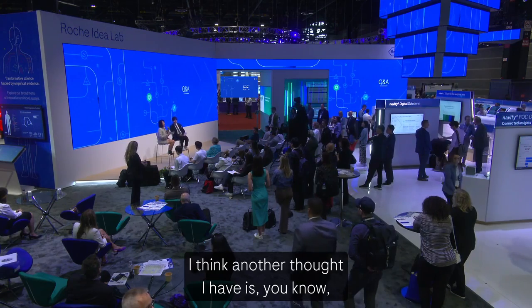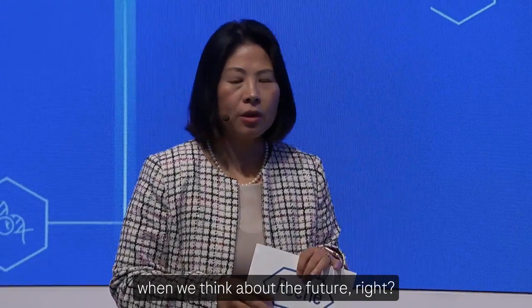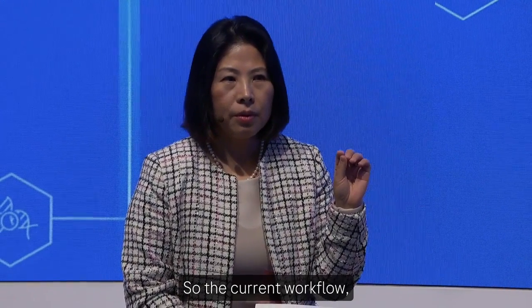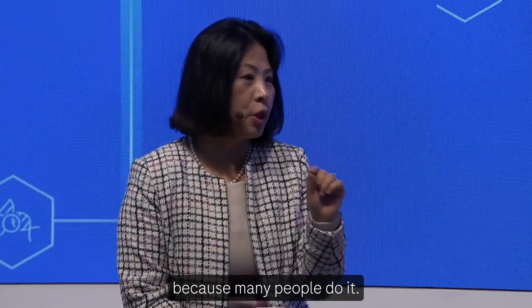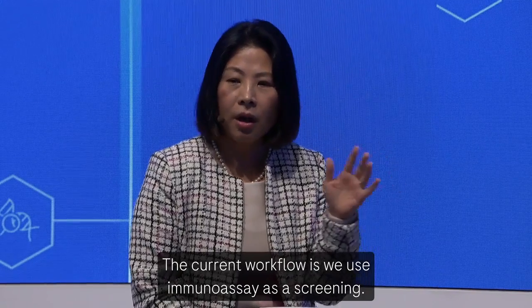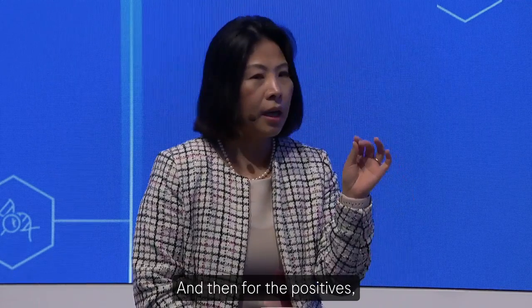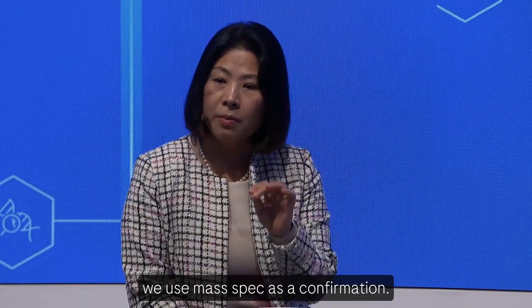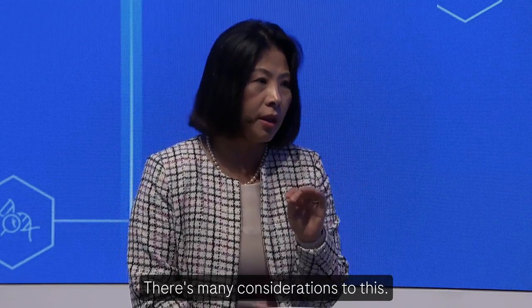I think another thought I have is, when we think about the future, right? The current workflow, I use drug abuse as an example because many people do it. That's one of the largest assays that we have. The current workflow is we use immunoassay as a screening, and then for the positives, we use mass spec as a confirmation. There are many considerations to this.